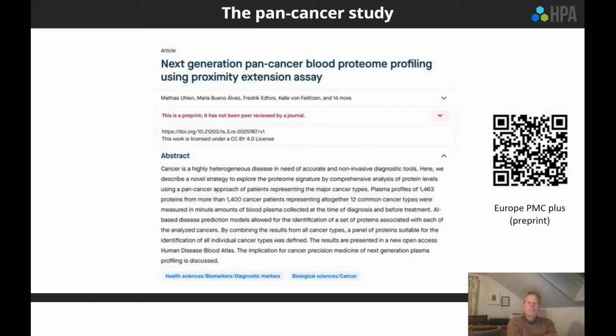I really appreciate how you closed in terms of looking at screening applications and false positives and false negatives. And naturally, you have to get disease prevalence in there as well. So it's a complicated set of considerations, right, in terms of positive predictive values and all that. One question, though, came in terms of validating with secondary assays. Would you say in the screening context for cancer, it would be just conventional diagnostic techniques, right, that you would look at someone possibly screened for cancer, and then they look at it via regular diagnostics? Can you comment on that?